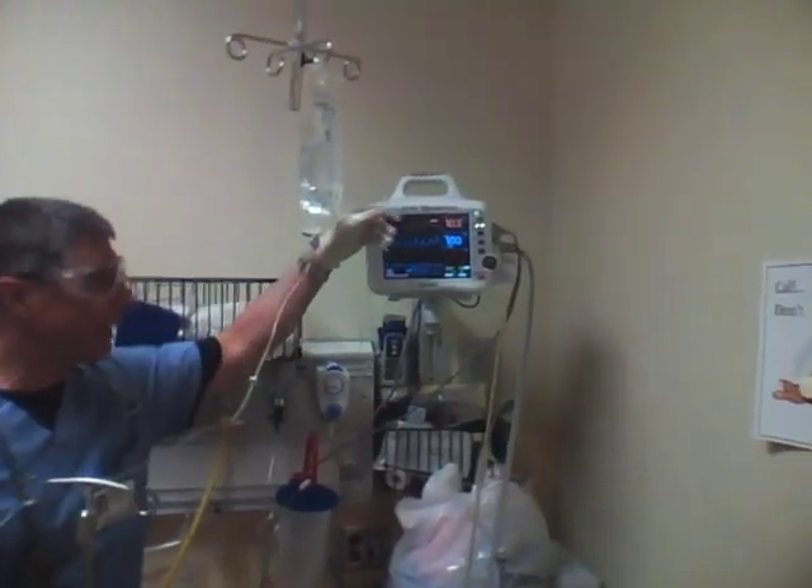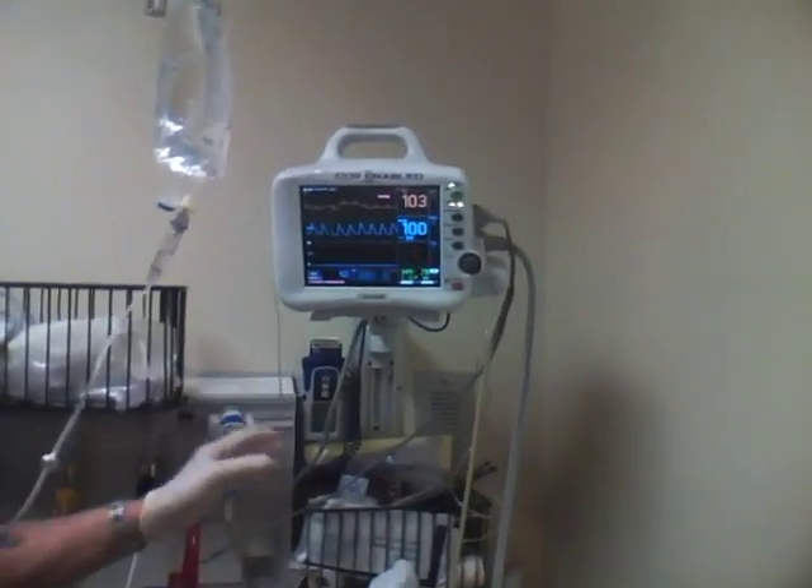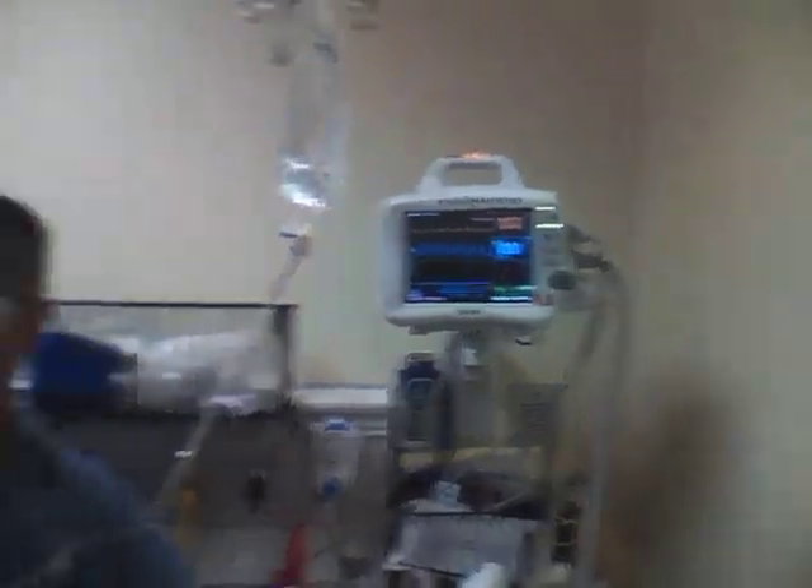As always, the capnometer is set up so we can monitor her end-tidal function as soon as she's intubated. She's on a pulse ox and a continuous cardiac monitor and blood pressure monitor.